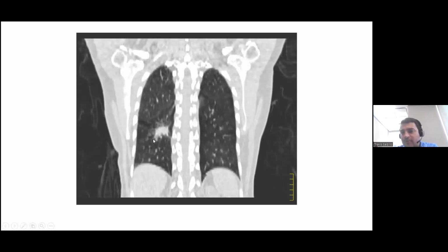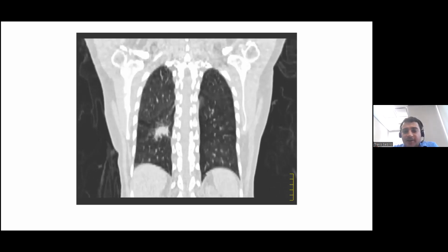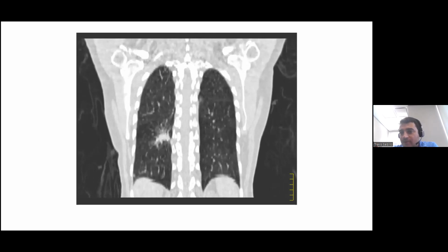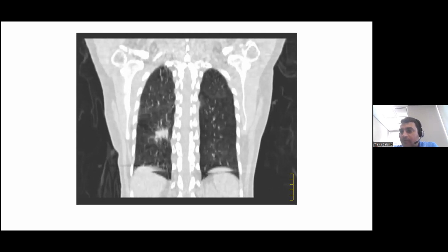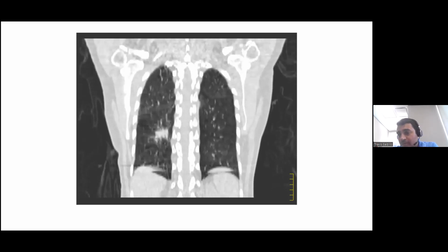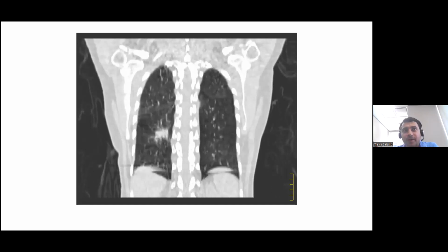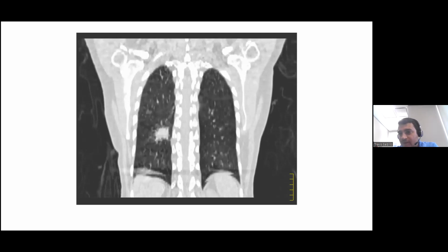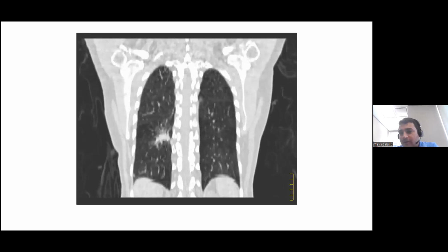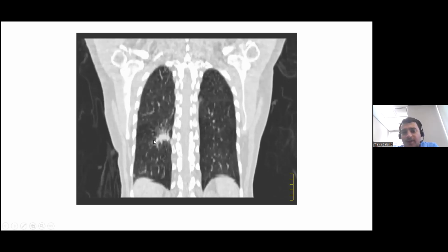I don't know if you saw on the previous slide, but task group TG76 recommends that anytime your peak motion is greater than 5 millimeters, you should probably do a breath hold for your planning and for your treatment. At MD Anderson, we don't. We use 10 millimeters. That's based off the experiences of our physicians and the comfort that they have administering a margin associated with 10 millimeters of motion. But I do know clinics that stick with 5 millimeters as is recommended by the task group.